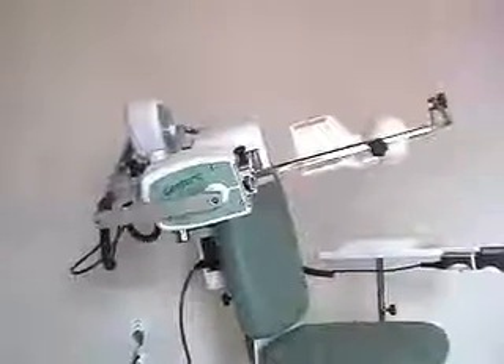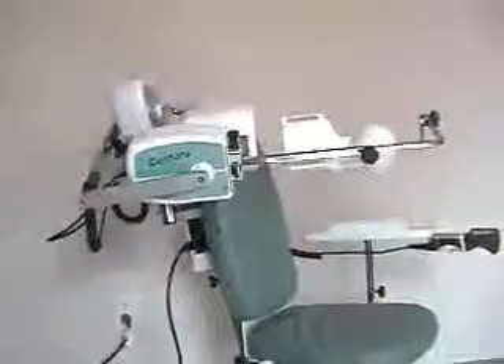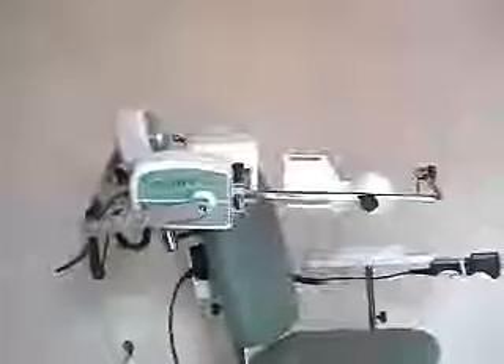Here we now have just the second motor, M2, doing rotation only, with no abduction or adduction occurring.